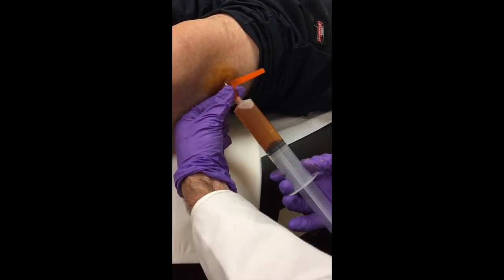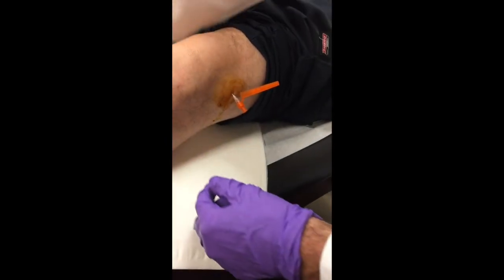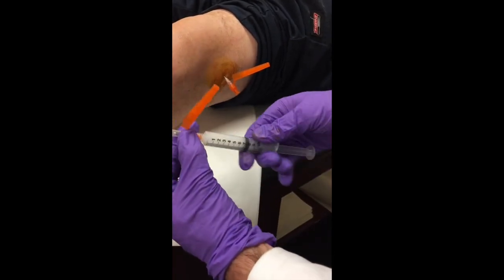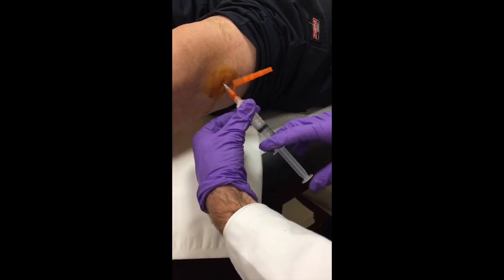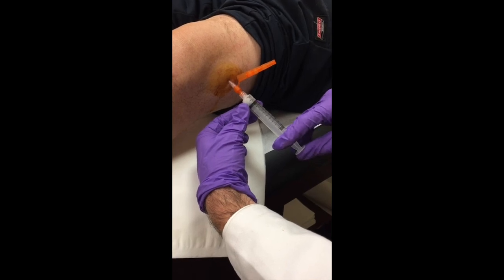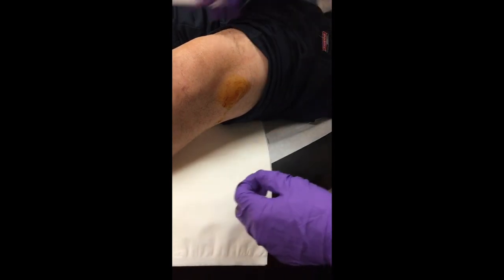Now we dislodge by holding the orange safety cap and unscrewing, then set this down. We take our cortisone injection — already shaken up — remove the cap, hook it back up nice and tight, push the medication in, and you're done. That's it.